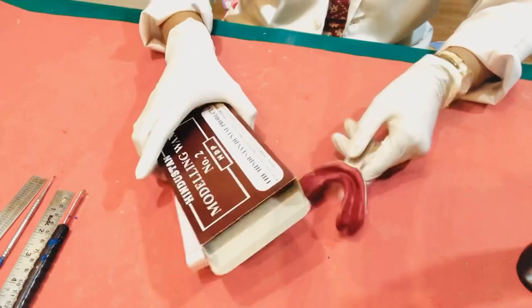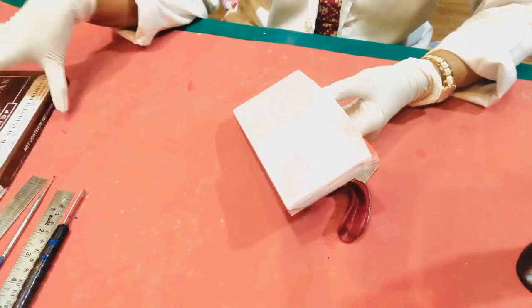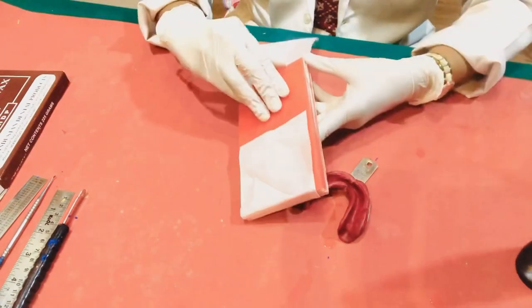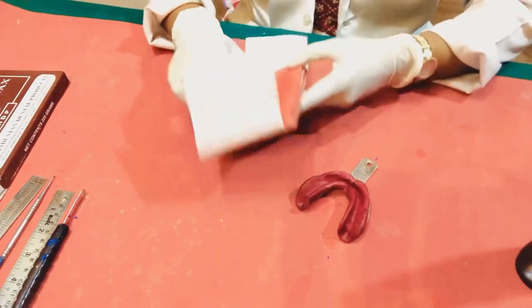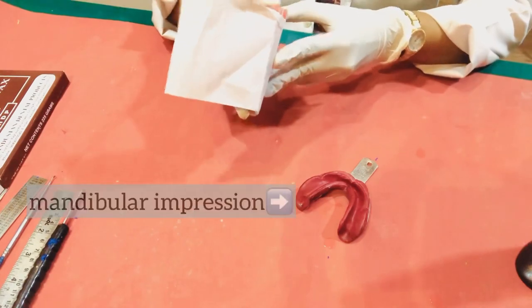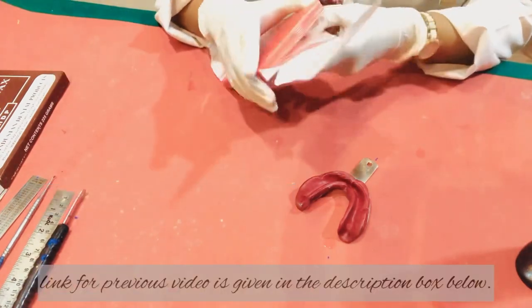Hello, welcome back. This is a continuation of the previous video where we saw beading and boxing of maxillary impression. In this session I shall show you how to do the same on mandibular impression with modeling wax. Please watch both the videos.